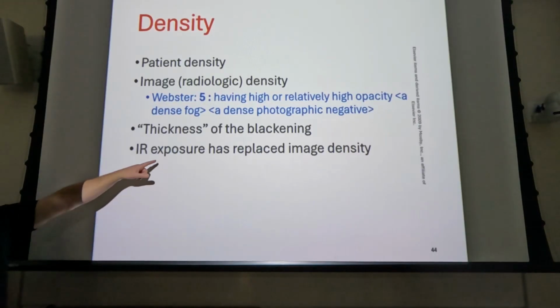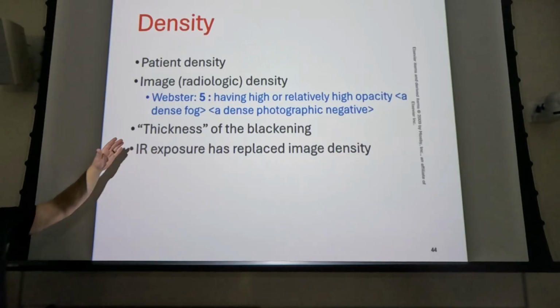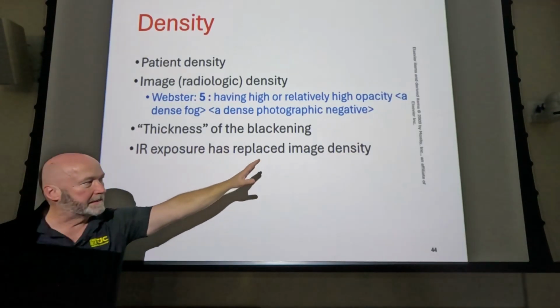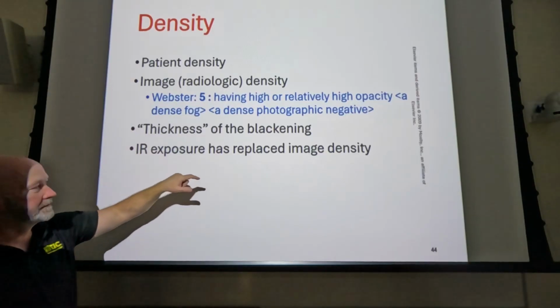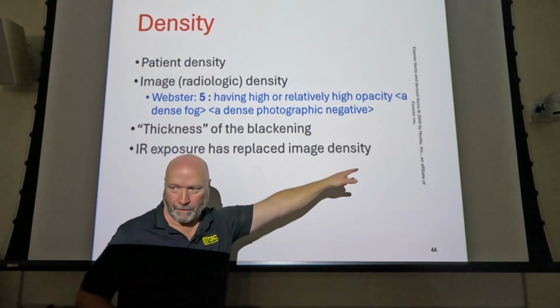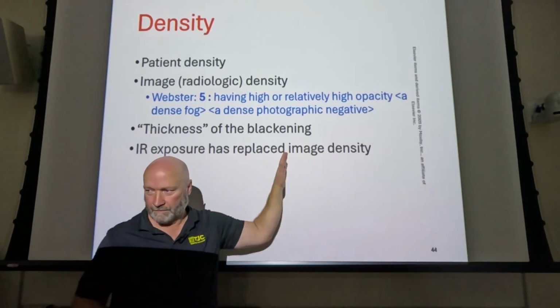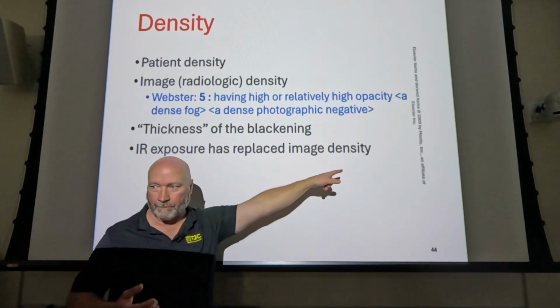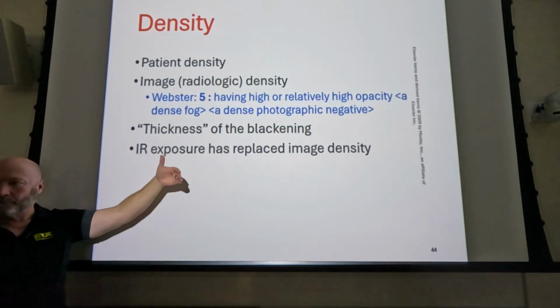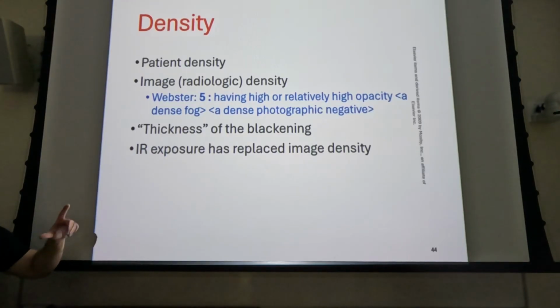You're looking at black and white here, that's high contrast. If I took this entire sentence and went from the I being white to the Y being black, and each one was a little bit different, increasing in density all the way until it got to the black one, then those densities are spread out over a very wide margin.